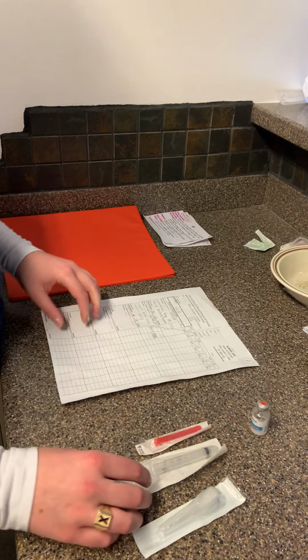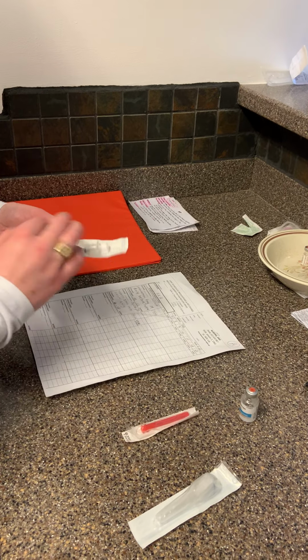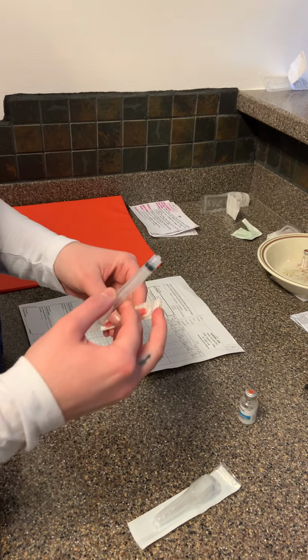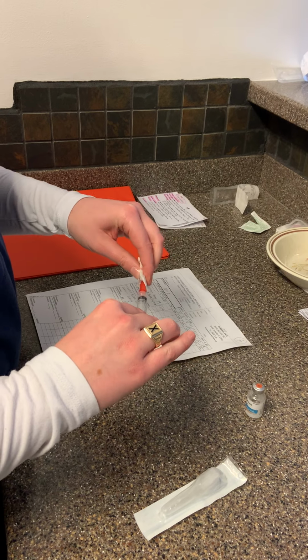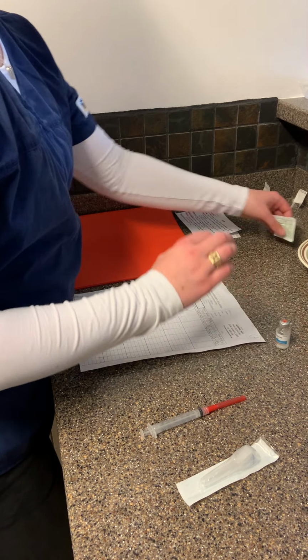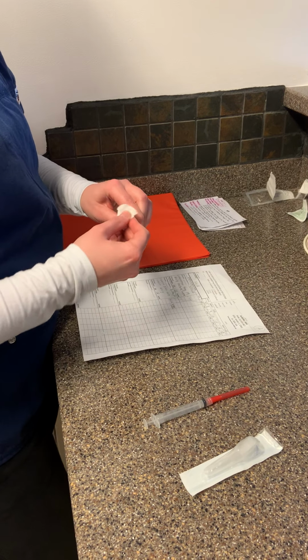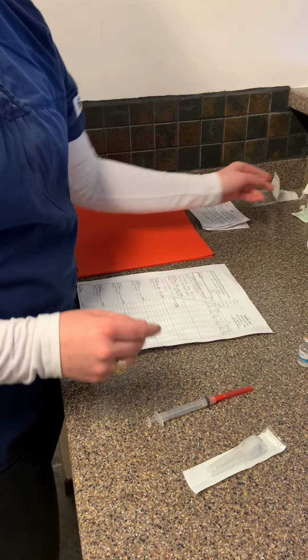Okay, so now I'm going to prepare my syringe here. Throw that in the garbage, and since this is a single dose vial, I will open it and then I will clean it with an alcohol swab for 30 seconds in a circular motion. So that was 30 seconds, throw that in the garbage.